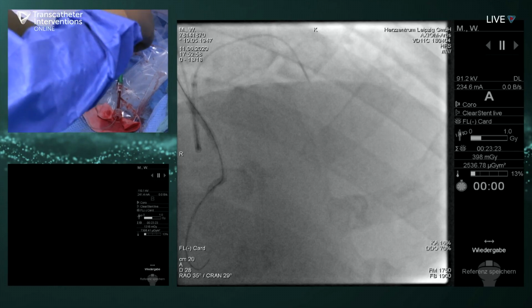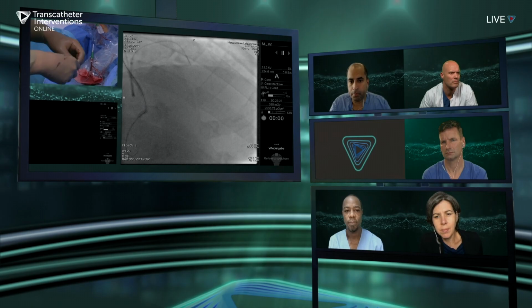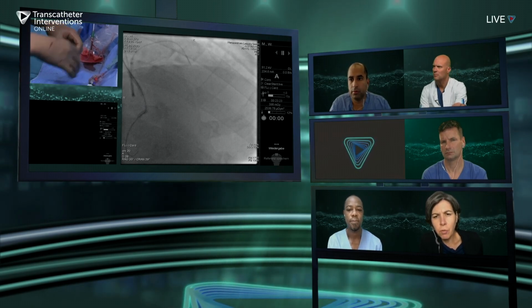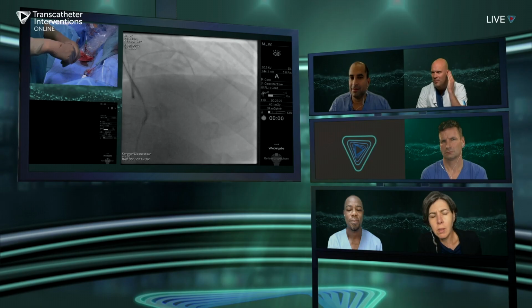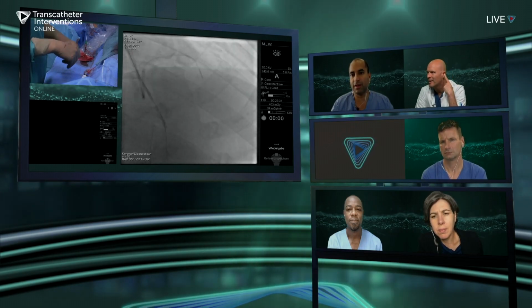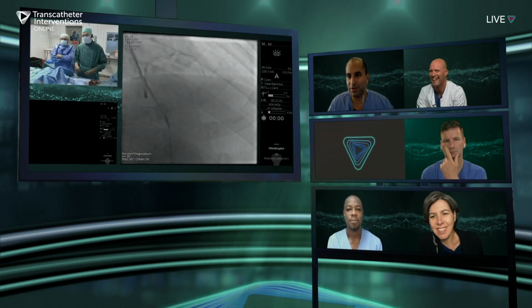So really, really tiny bend because the septals are going to be small. And then we'll see surfing. Ajay, what's your first? So I know Nicolas wanted to see septal surfing, but in the last case, they went epicardial, so now we get to see our septal surfing. So we're good.